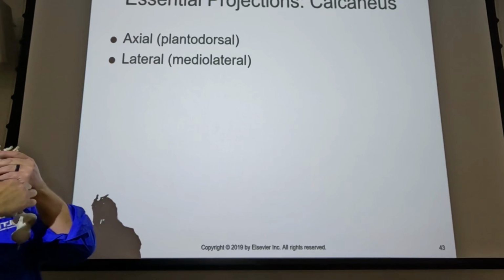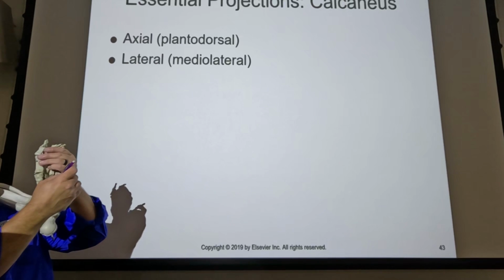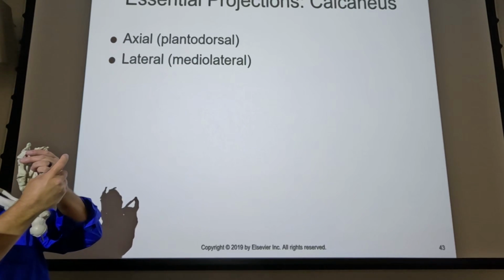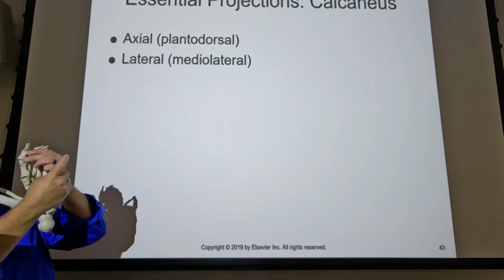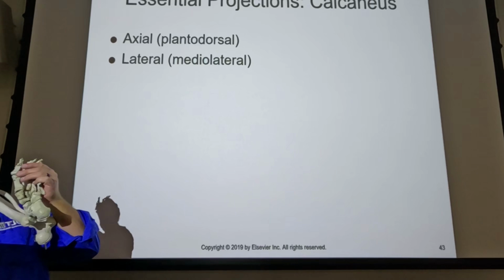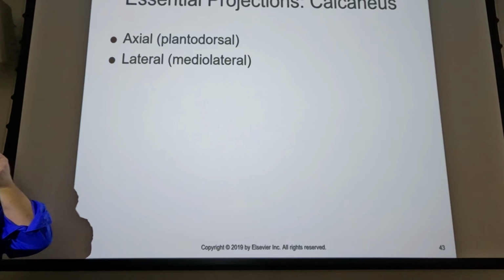If they can't dorsiflex their foot, get this. So watch. You've got 40 degree angulation at 90 degrees. This is visual. Just increase your angulation. Okay, may not be ideal, right? And it won't be ideal. 90 degrees and 40 degrees, that's ideal.